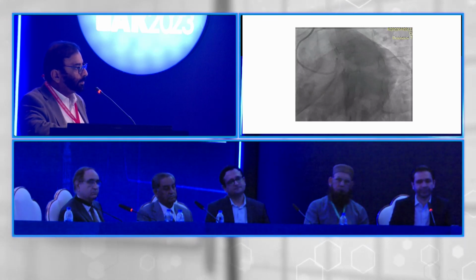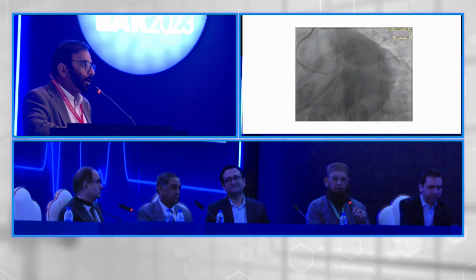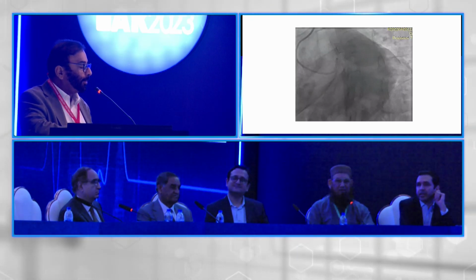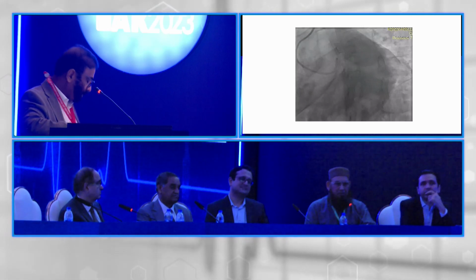Dr. Tariq, you are so fond of the cutting balloon and high-pressure non-compliant balloons, which we rarely use, but you are very fond of these sorts of gadgets. So over to you for your comments.